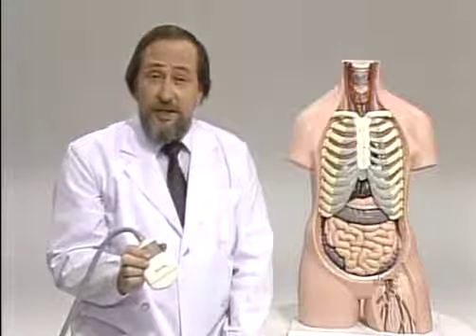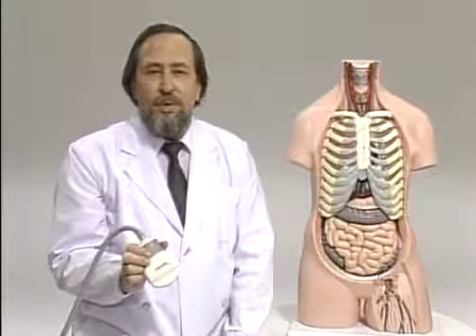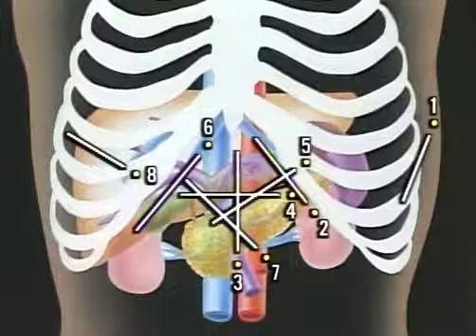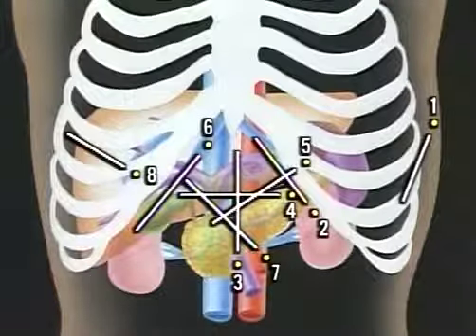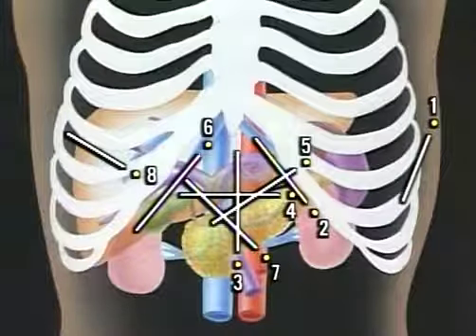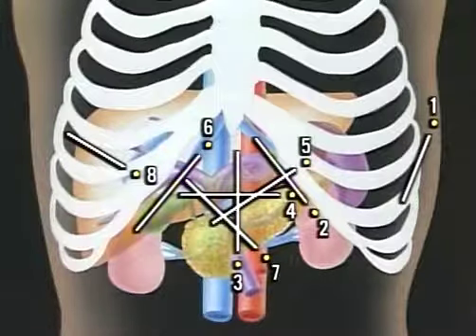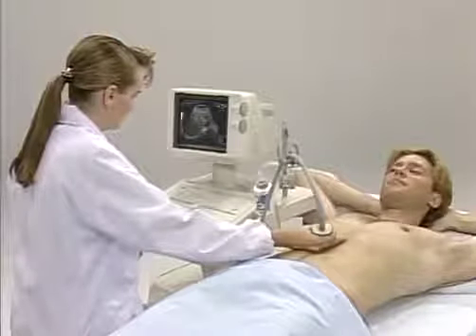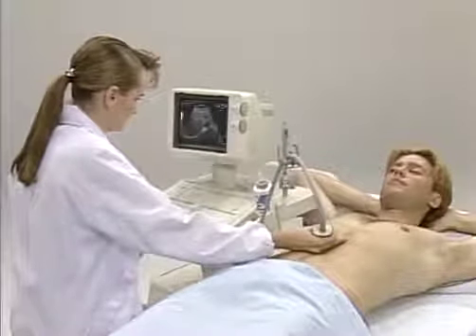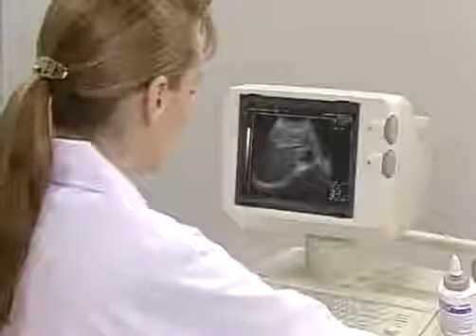Have you understood the basic procedures? It is up to the sonographer to determine the order in which the procedures are performed. Start by scanning the region which you can examine most easily. What is important is that you must scan each region thoroughly and must not miss any sign of disease. Images obtained on each plane should be recorded as hard copies, even if there is no abnormality.